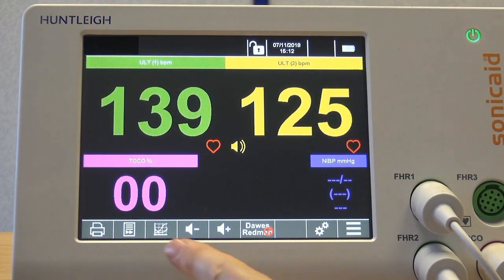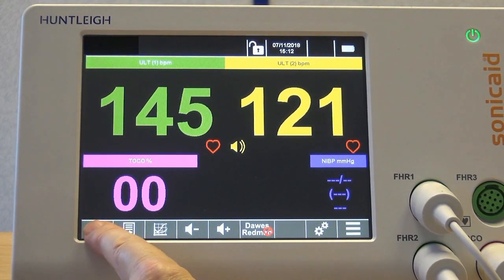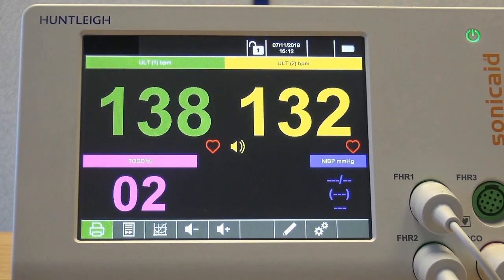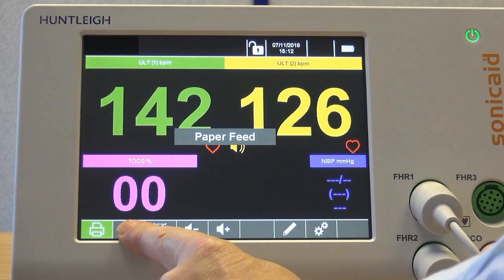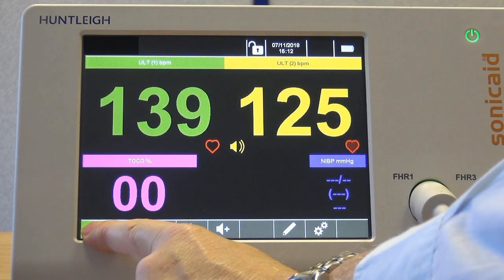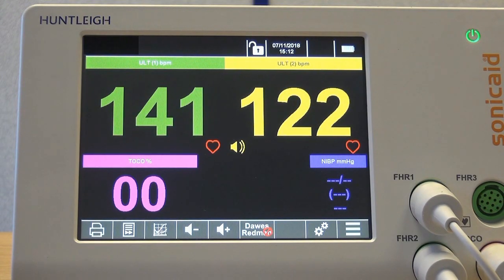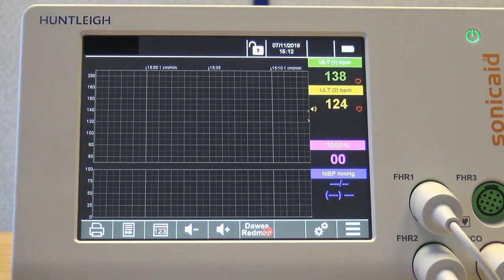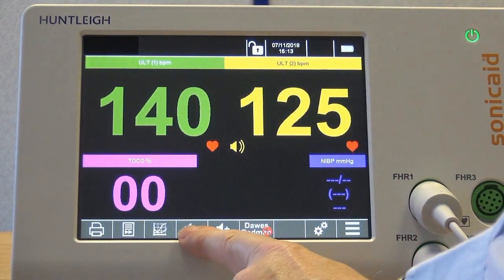Along the bottom of the screen you will find a number of function buttons: a printer on/off button, a paper feed button, and a trace/big numbers view button. Use this to switch between the trace view and big numbers view during live traces. There are also volume buttons.